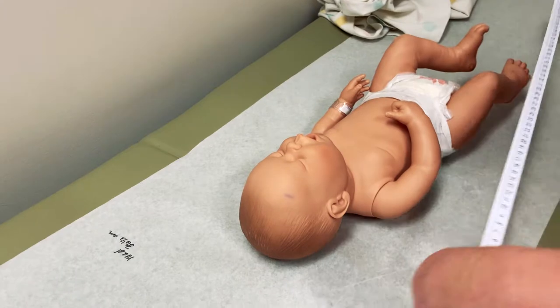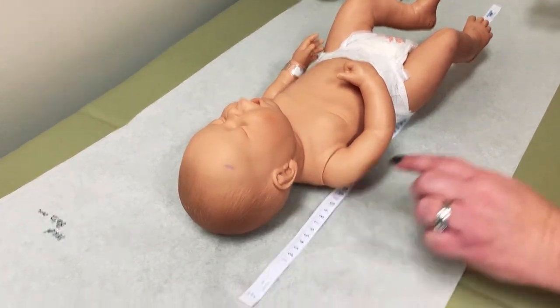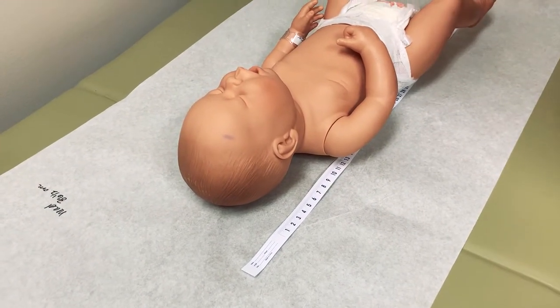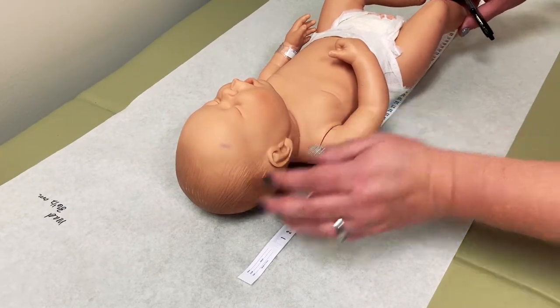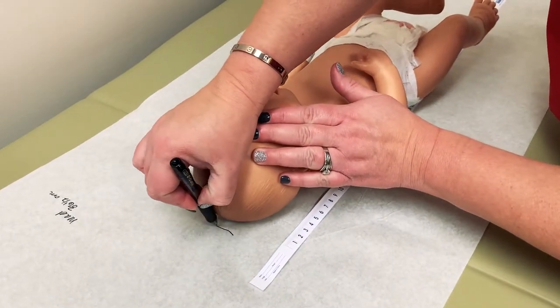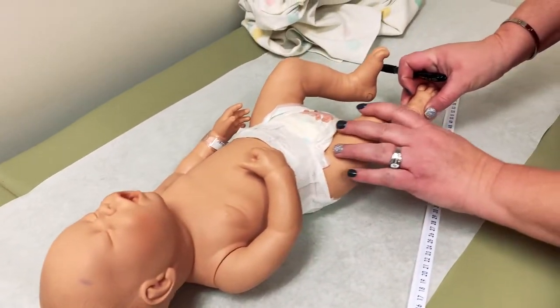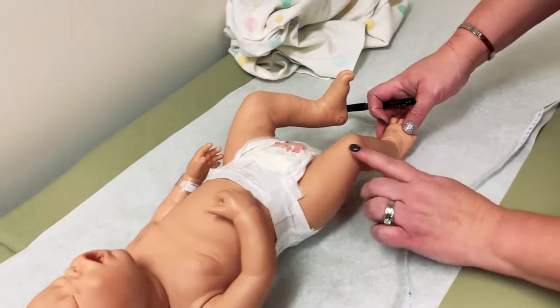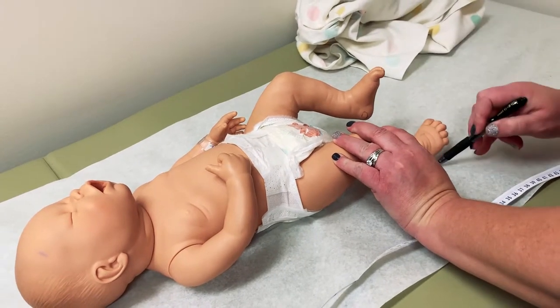Next you want to do their length. You want to go from the top of their head — now this is a little bit easier to do when the baby is not squirming and crying. What you need to do is try to go from the top of the head and make a mark up there, and then you want to try to stretch the baby's leg, one leg, all the way out as much as possible, and then make another mark.